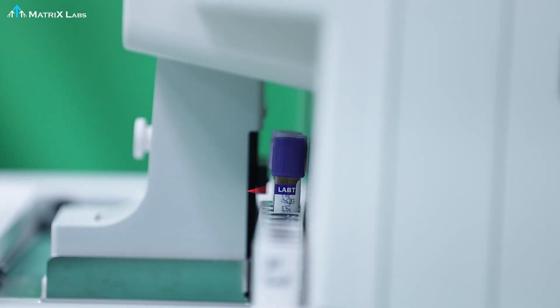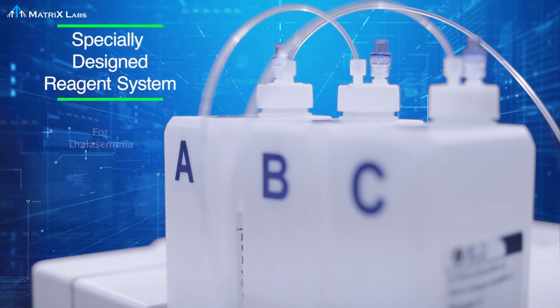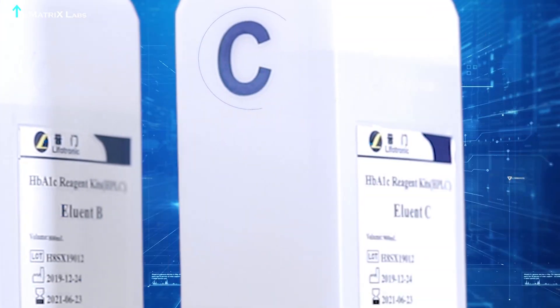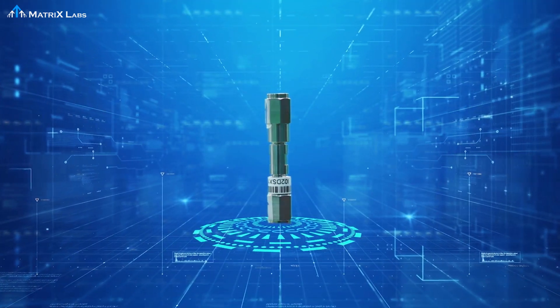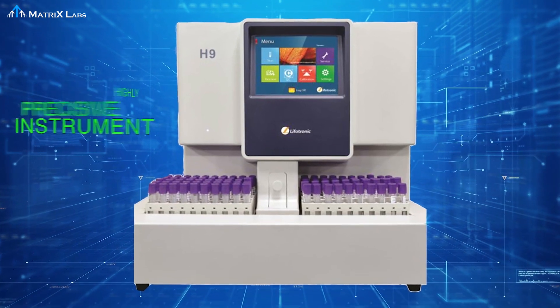A built-in barcode scanner helps in sample identification. H9 features a specially designed reagent system consisting of eluent A, eluent B, eluent C, hemolizing reagent, calibrators, and QC — along with a column and filter — making H9 a highly precise instrument.